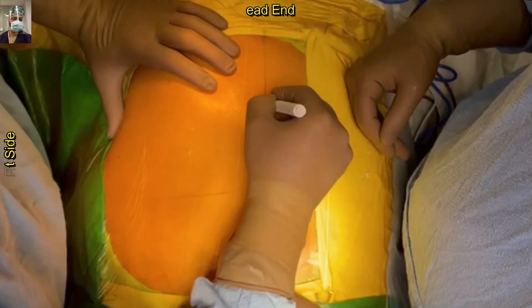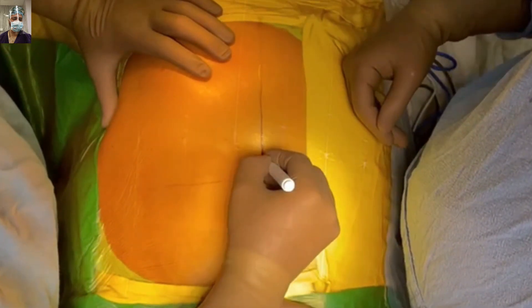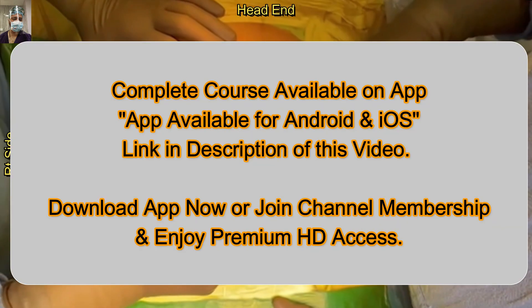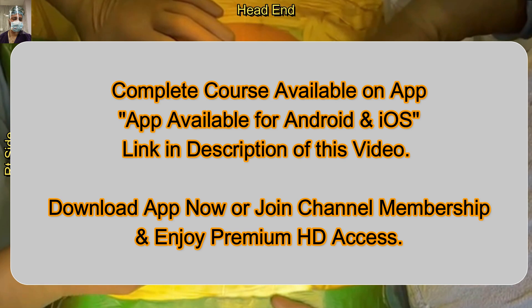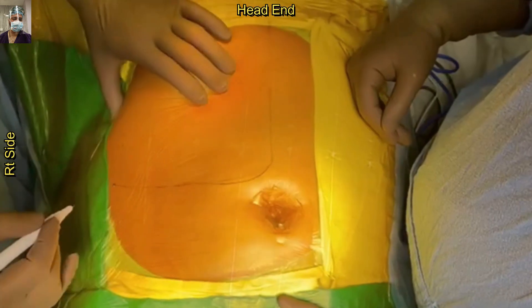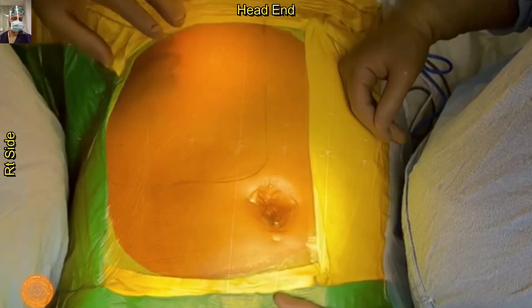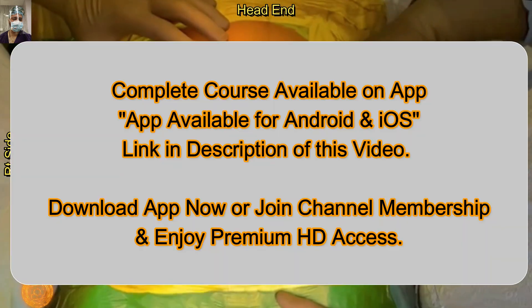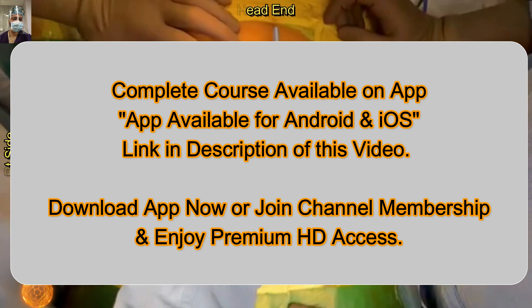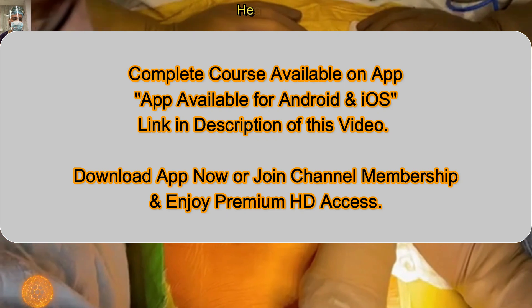The patient is already under general anesthesia in the supine position. For this choledochal cyst excision, we usually keep a small bolster beneath the right costal margin to elevate the liver. After placing the Ioban drape, we are now marking the midline incision. This will be the right-sided modified Makuchi incision. For a better understanding of the theoretical background, please watch our 'Tricks of Trade in GI Surgery' series.